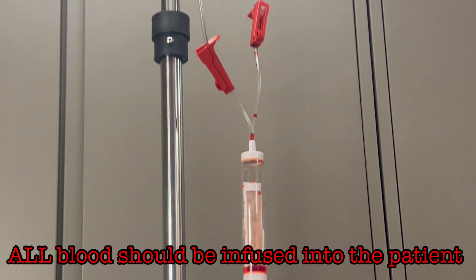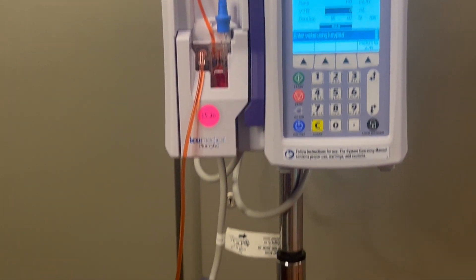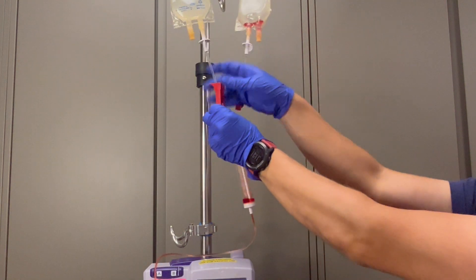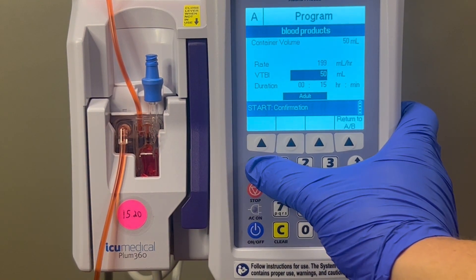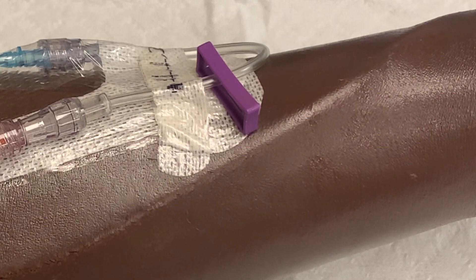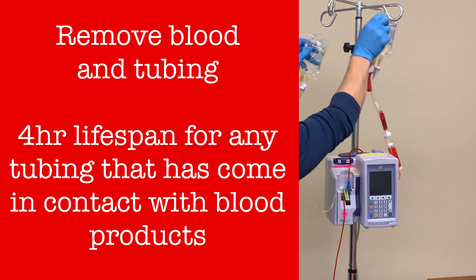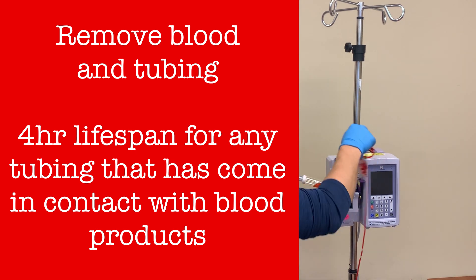When the unit is empty and the filter chamber is also empty of blood, there is still some blood in the tubing. To complete this transfusion, this fluid should also be infused into the patient. Close the roller clamp to the empty bag of blood and open the clamp to the saline bag. Prime a small amount of saline into the chamber and resume the infusion. When the tubing is completely filled with saline, the transfusion will be completed. Obtain a set of vitals at this time. Now remove the blood product bag and dispose of it — no blood product bags or tubing, either full or empty, should ever be left in a room if they are not actively in use.